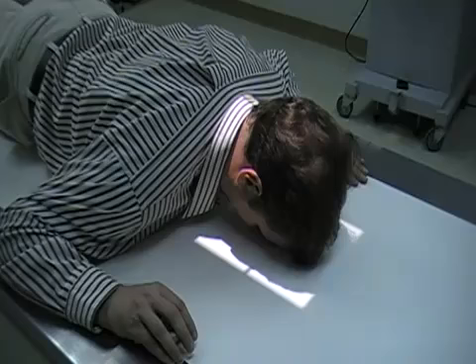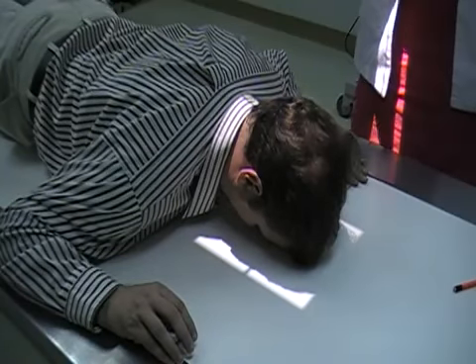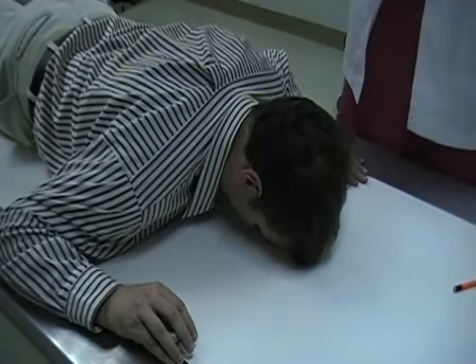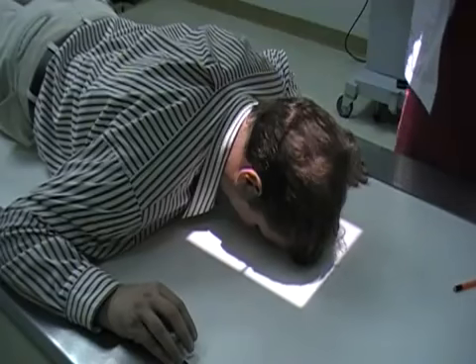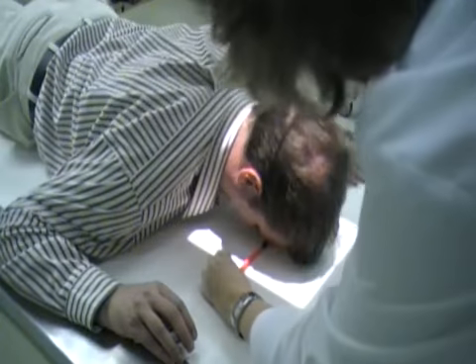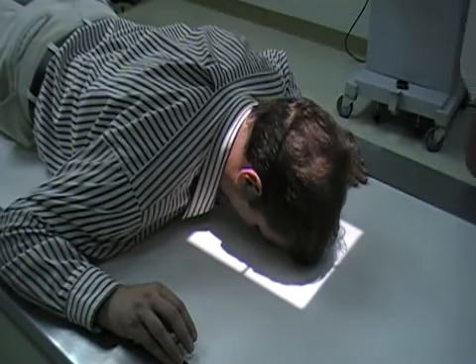So this is our PA, and then for the PA axial or the Caldwell, the patient holds that position and we do a 15-degree caudal angle. And again, you want to check and make sure that the central ray is exiting at the same level as the nasion. Okay.